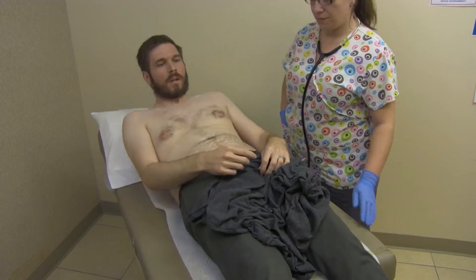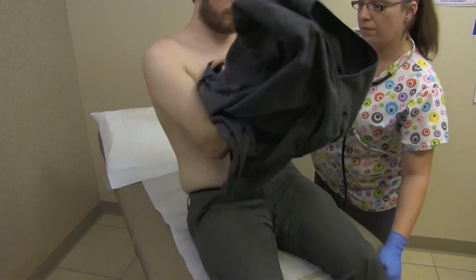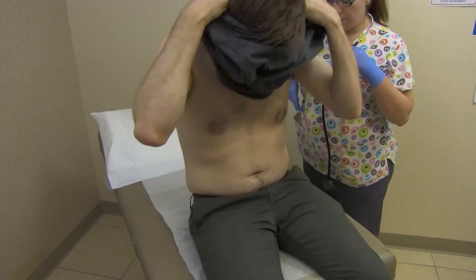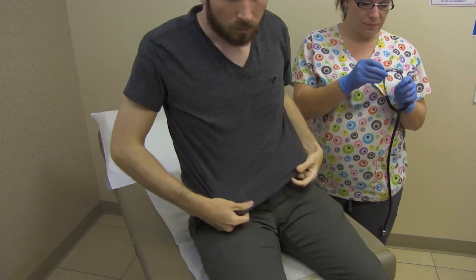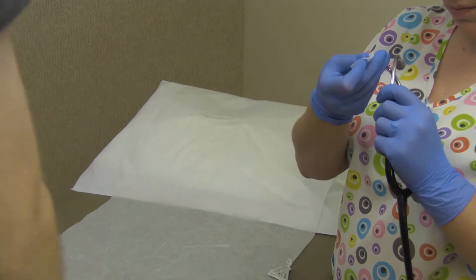Note any additional heart sounds or irregularities you may hear. Assist the patient to sit up and dress. Wipe the stethoscope earpieces, tubing, and bell with an alcohol prep.